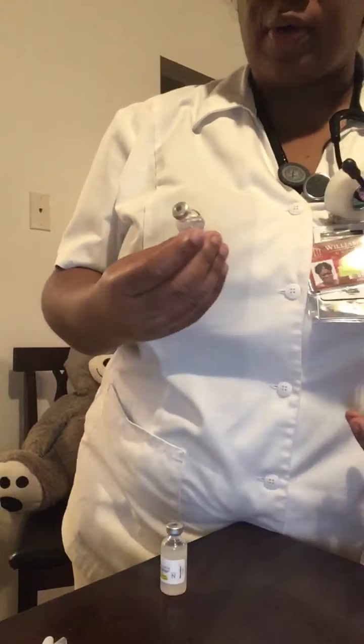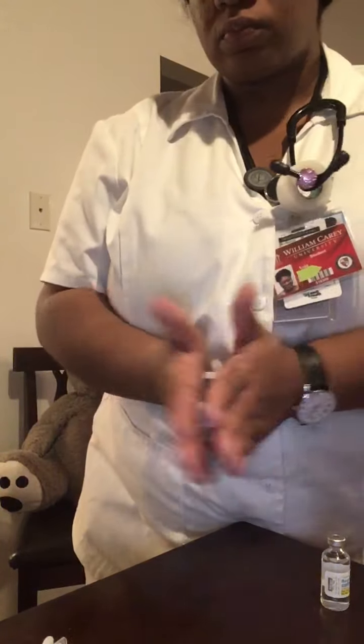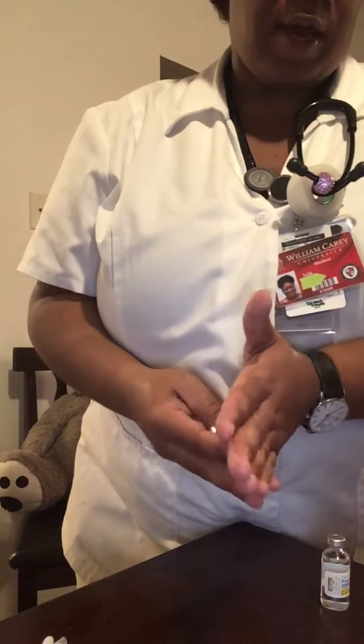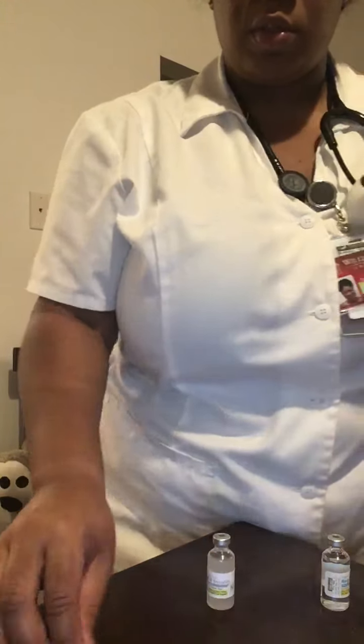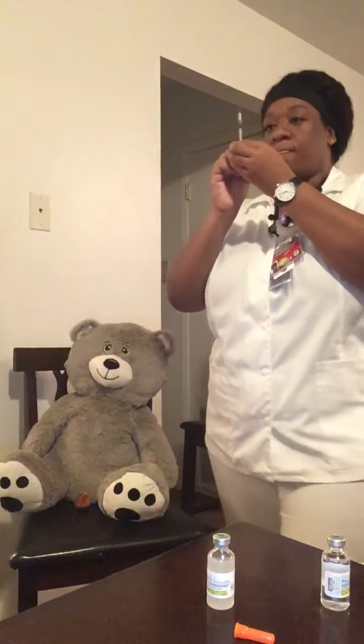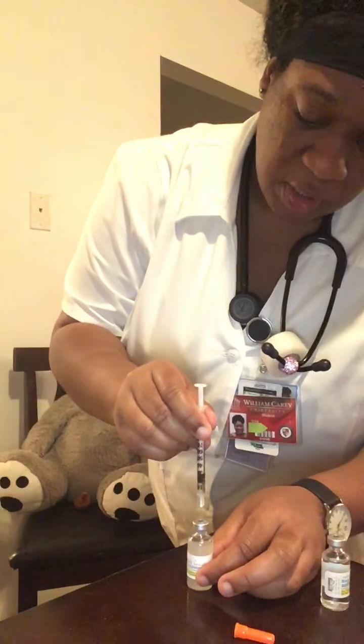So I will go and do my first check here. I have regular insulin, 6 units. We're going to roll the vial. And then I have 16 of NPH. We're going to roll the vial. Then what I'm going to do is inject 16 units of air into my cloudy first. So we're going to draw back 16 units of air. All right, so we're going to inject that into here.